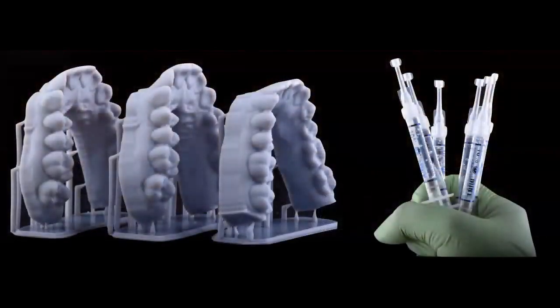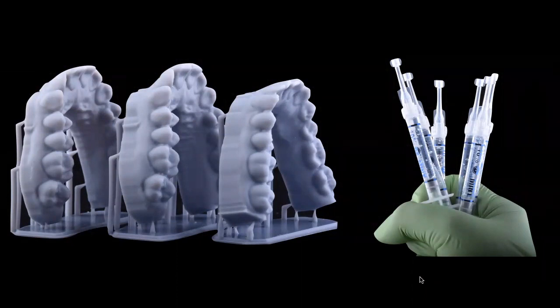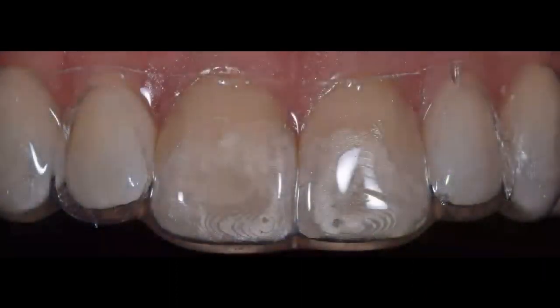In this particular case, we decided to scan her teeth and we printed out the models. We chose 10% carbamide peroxide to start with, and then we changed and combined this with 20%, which I'll explain a little later. We did the model and the soft bleaching tray. I want you to see that this bleaching tray has one little thing that is different. This is what we call the dark tooth bleaching tray design, which you can see has two windows on 7 and 10.